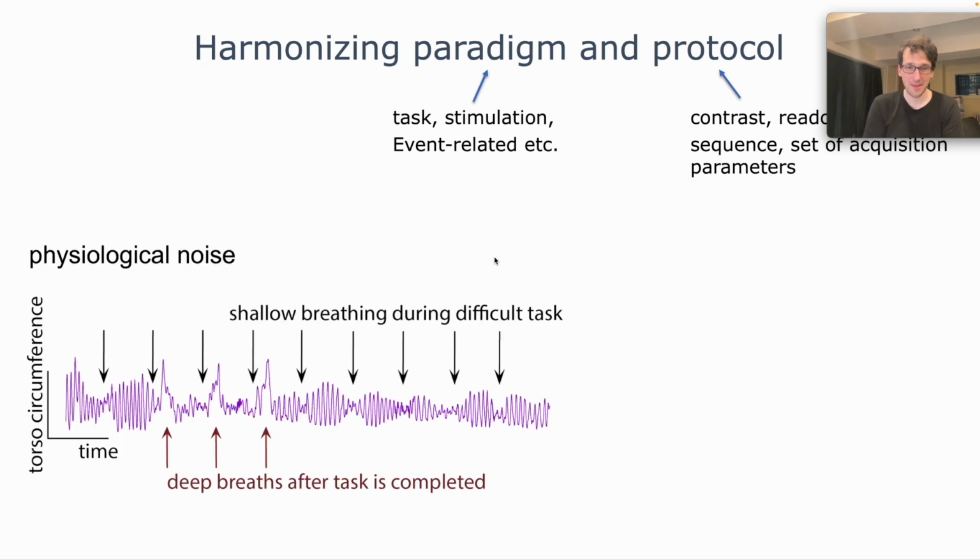So first example, let's look here at the respiration curve of a cognitive task that was particularly challenging. Participants saw strings of letters like X, W, E, F, and then they had to sort them according to the alphabet, which is a hard task, right? And they had to focus really. All the black arrows here are pointing to events where they had these strings of letters and had to sort them according to the alphabet.